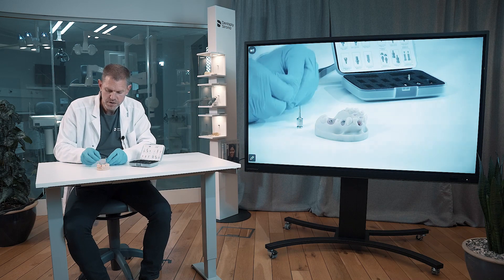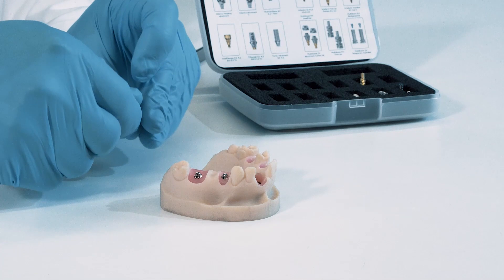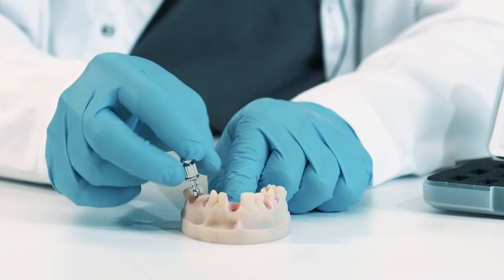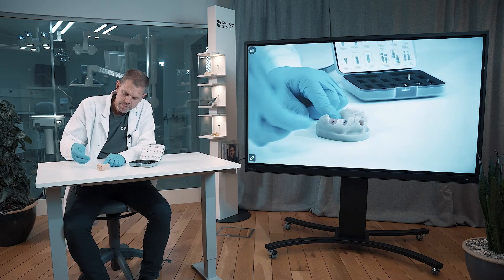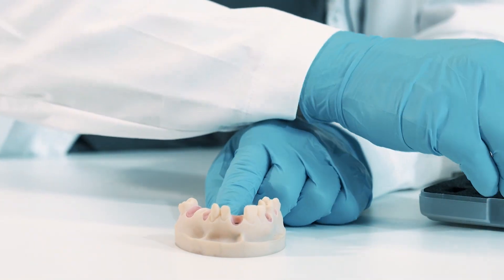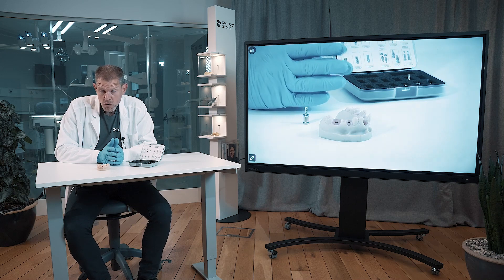I switch the hex driver to the multi-base driver into my restorative driver handle — the one from when I showed you how to install. Now I can uninstall these abutments the same way, by just taking them out. That's all you have to know for now about the multi-base abutment for screw-retained restorations and multi-units.